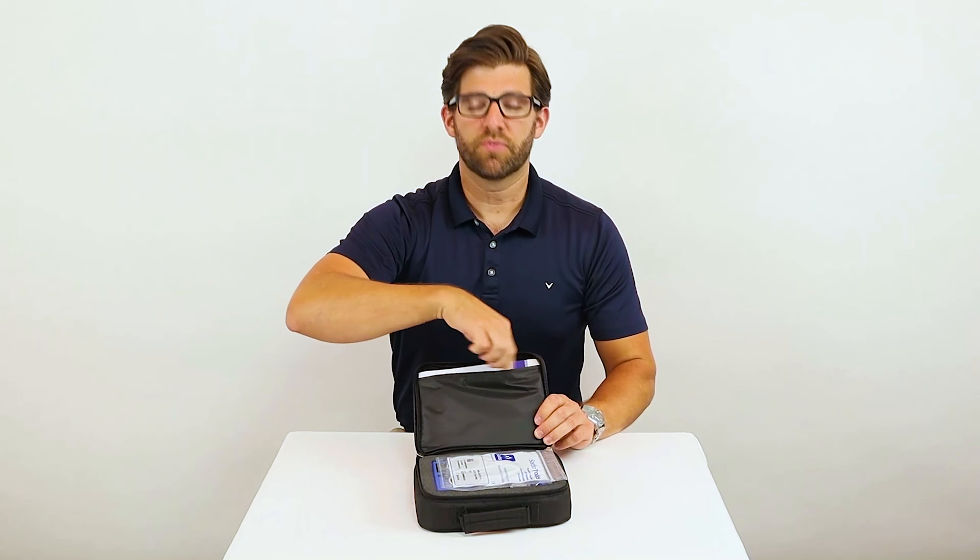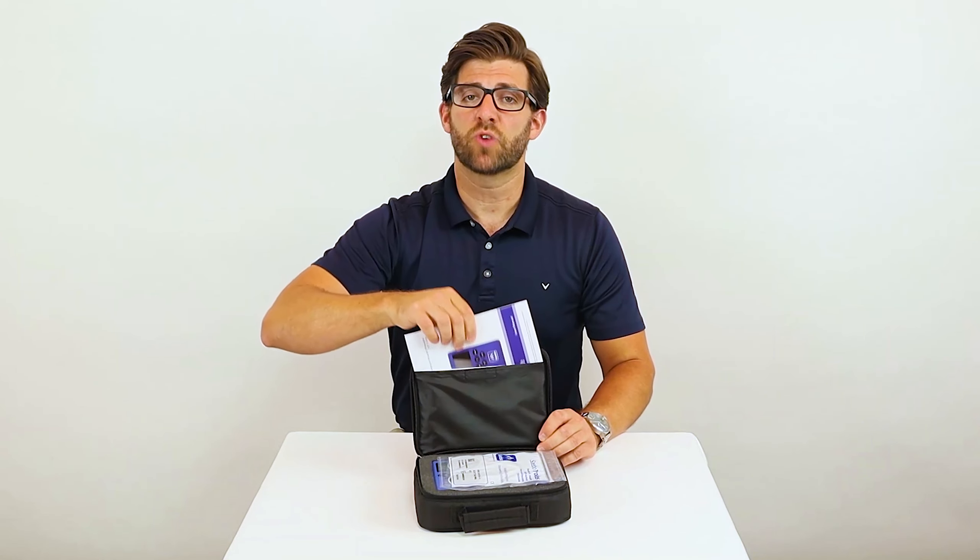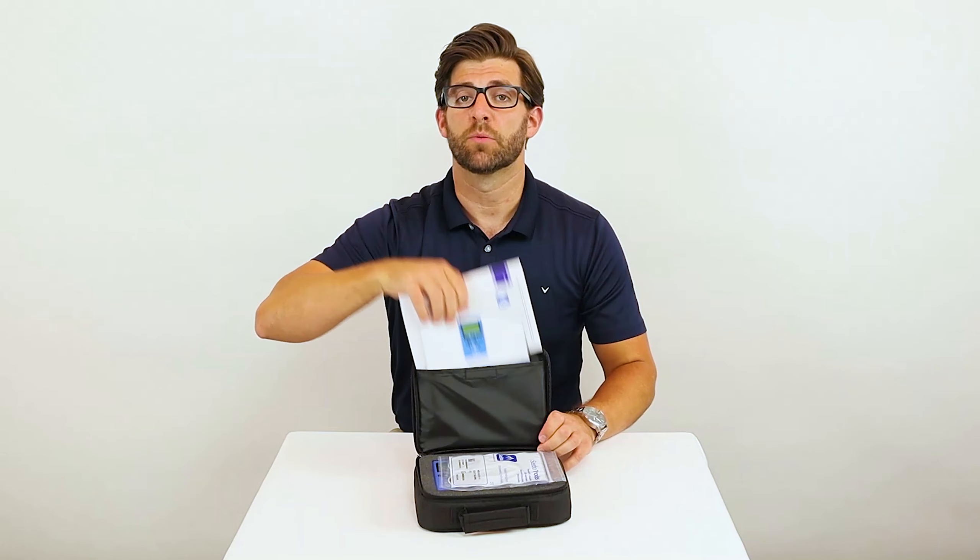On the inside of the lid, you'll find manuals. Make sure that you read these because they have instructions, troubleshooting, and tips and tricks on how to use your Sable Stim Pro.